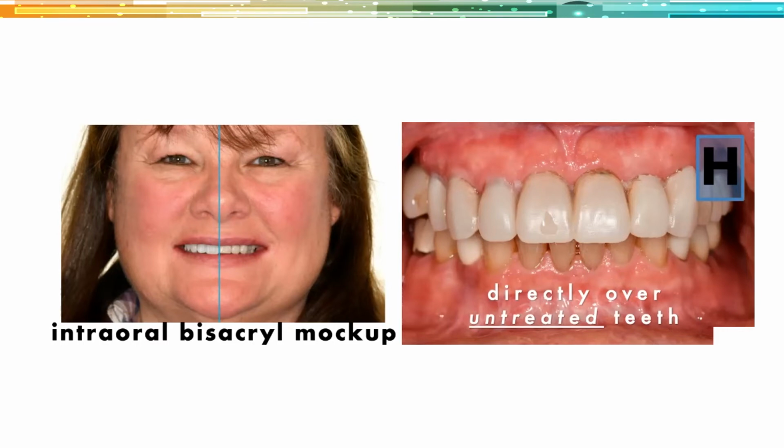And now we can basically see, is what we designed on the computer screen actually going to work in a functional way for this patient? Because we can make things look however we want in the software, but it actually has to function in the patient. And this is actually more for me than the patients in some way. It's more for us really, because we can really see if this is actually going to fly, or if something is way off.